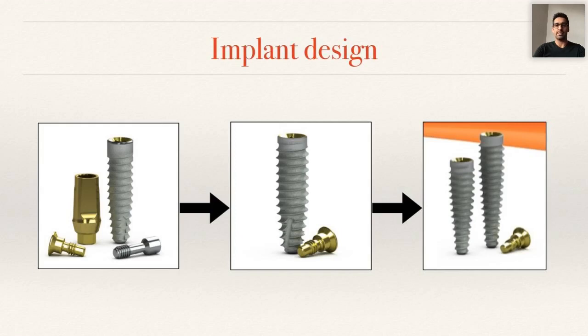And that allows us to get higher torque and minimize the amount of drilling that needs to be carried out. So the pterygoid implant on the far right is a 4.2 with a 3.5 platform, with more of an exaggerated taper. A distinct difference between the pterygoid and the other implants is the apical diameter, which is really important, especially when we do full arch to get bicortical stabilization. The implants on the left are 2.8 in diameter apically, but this pterygoid implant is 2.2.